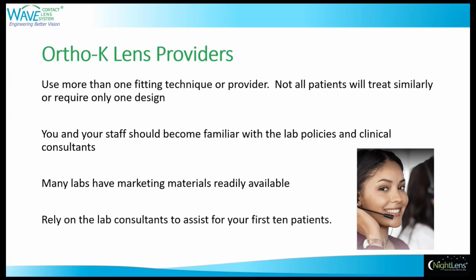Now, as far as the lab consultants are concerned, these are very valuable to you for at least your first 10 patients. They will help you understand the designs, when and where you should make changes if applicable.